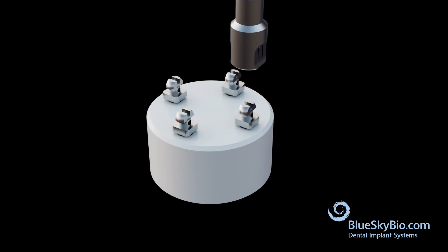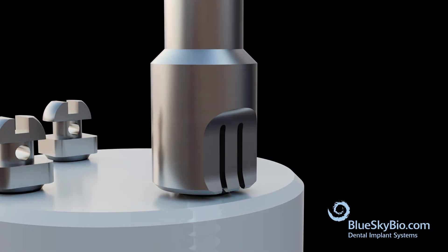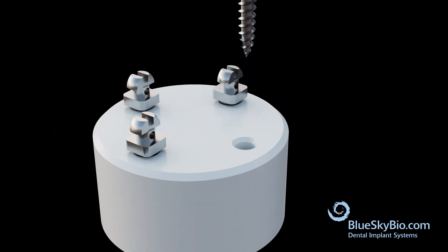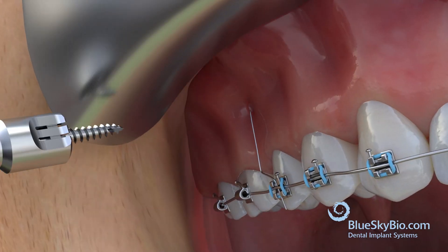Next, use the handpiece driver and pick a TAD out of the TAD holder. Align the retention fingers of the driver with the flat sides of the protrusions of the TAD. Using a handpiece, place the TAD into the bone.